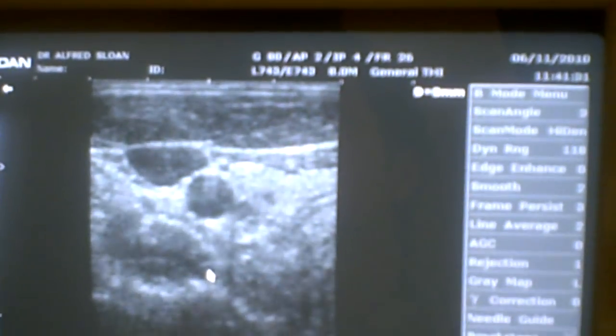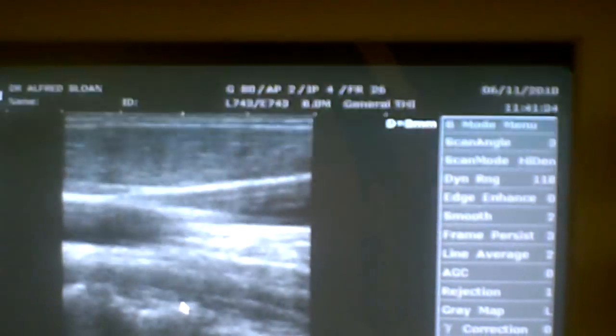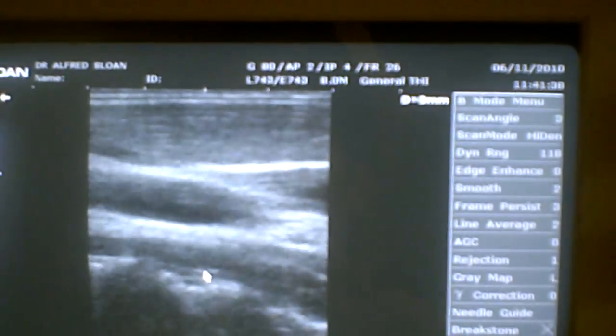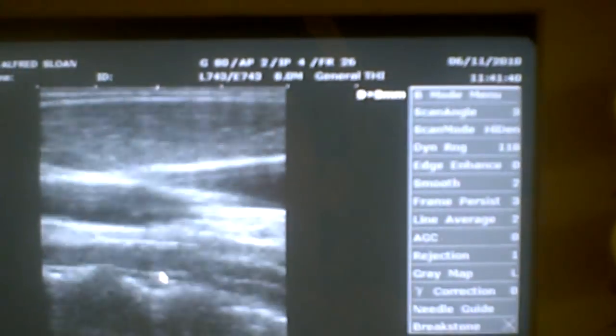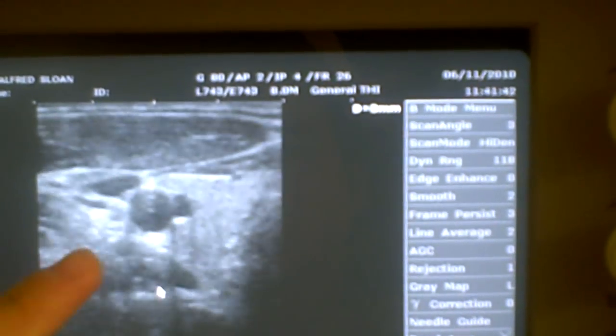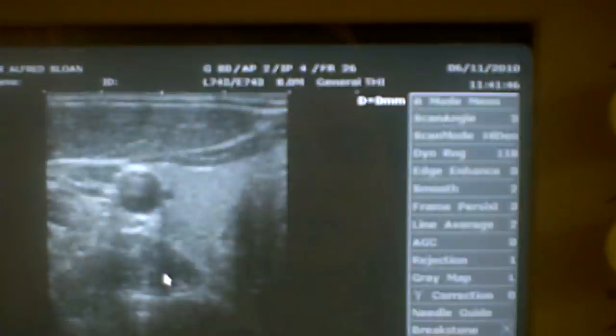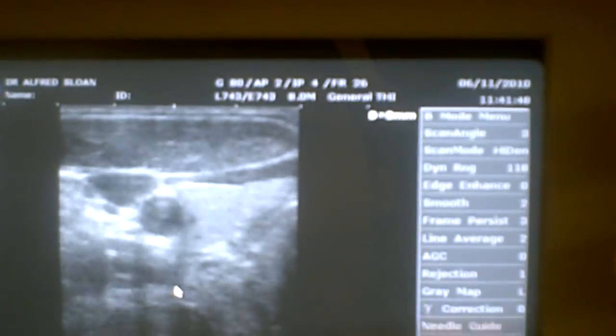We can see the artery there as well. He's repositioning it to locate — what else are we locating here? It's still the artery. I need to look from another angle. And we're looking at the artery from a different angle as well.